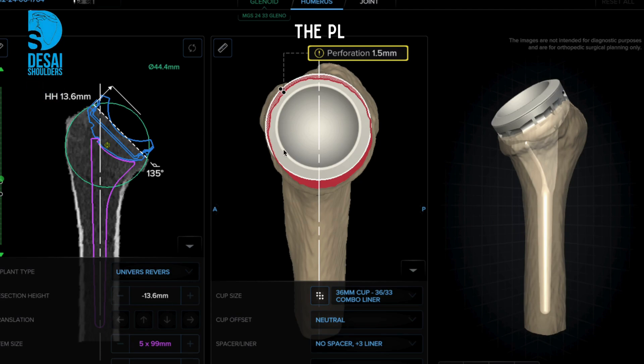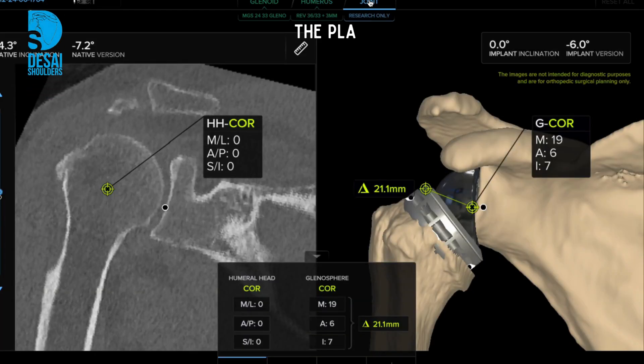On the humeral head side, the cut allowance is planned at 135 degrees to achieve the best range of motion and stability. We can now visualize the final implant positioning showing no scapula impingement.